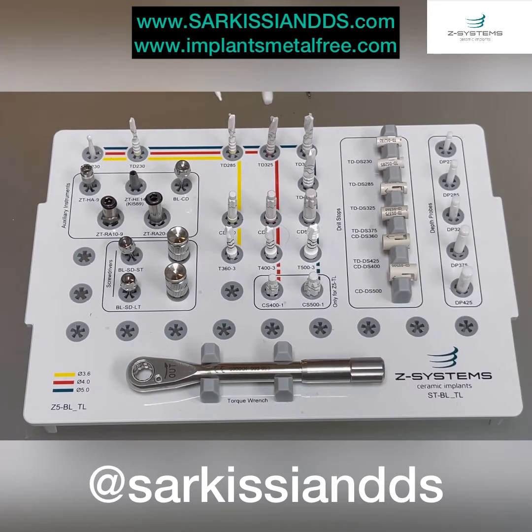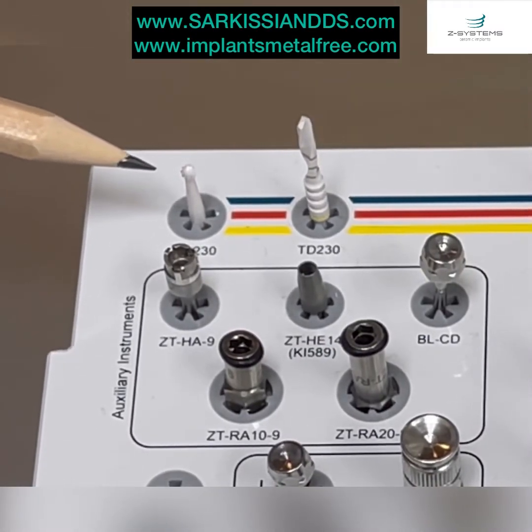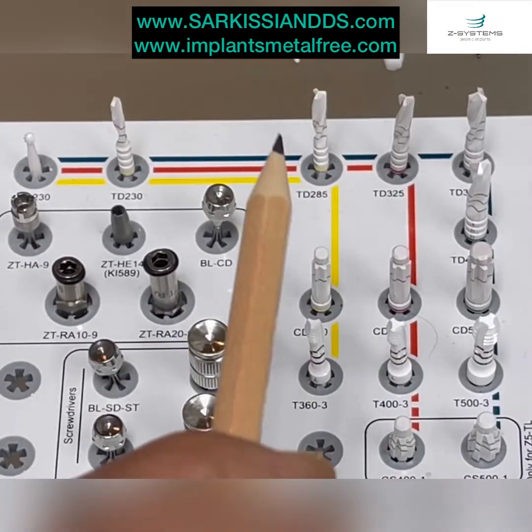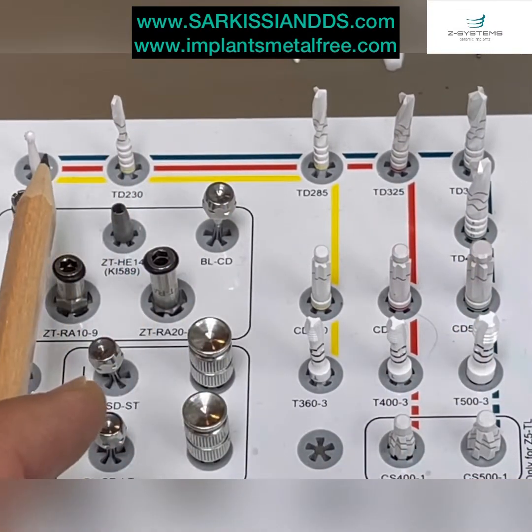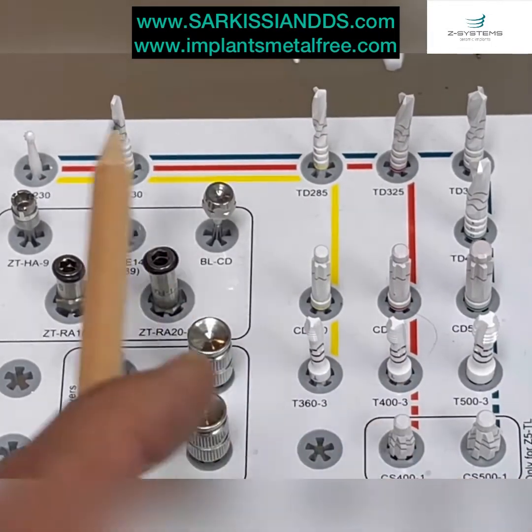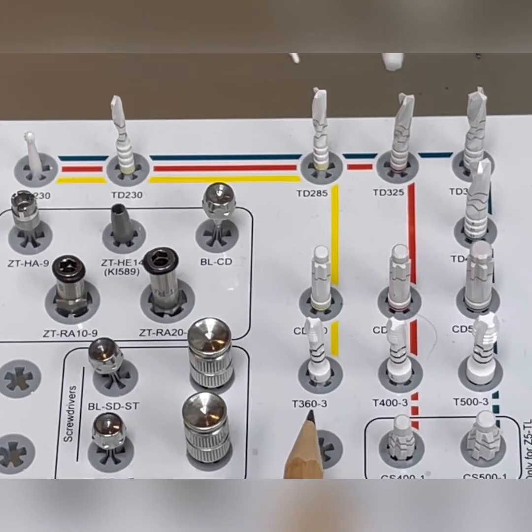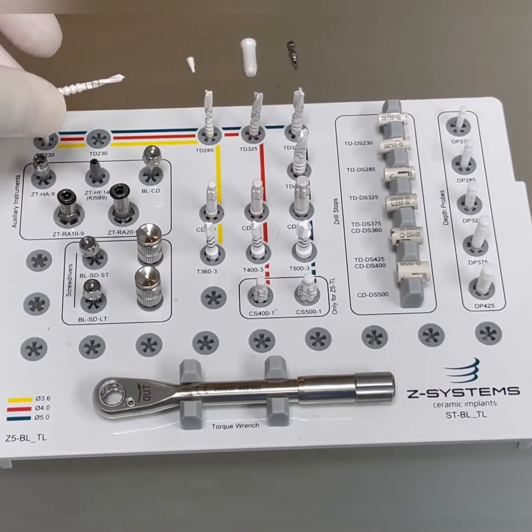A quick overview of the different bits: starting with the round burr, which is used to mark the ridge, and then the pilot drill. We then progress with the different sized drills depending on which implant we're placing — the green route for 5 mm implants, the red route for 4 mm implants, and the yellow route for the smallest, the 3.6 mm. All the burrs that drill in bone are made out of zirconia — they are metal free.